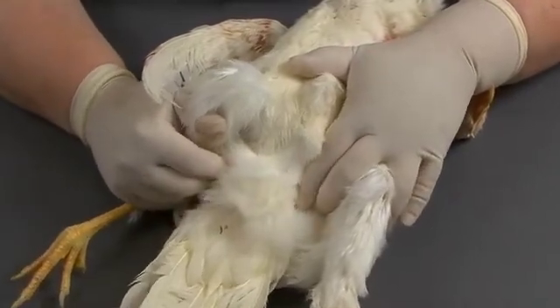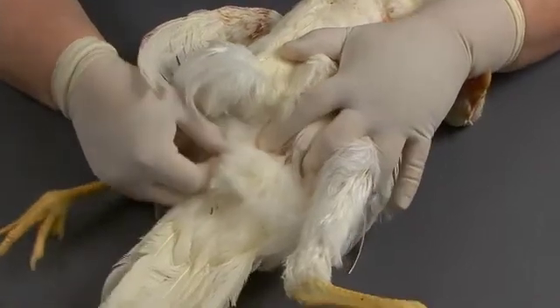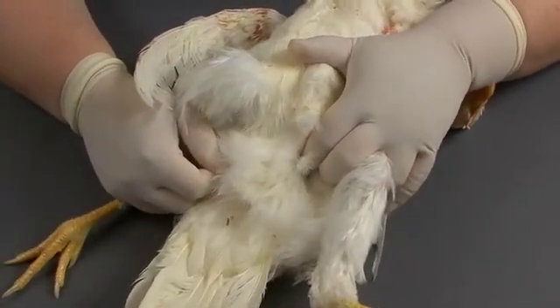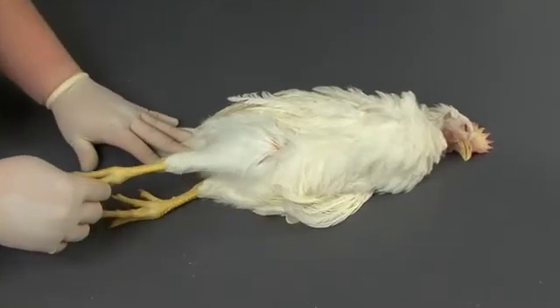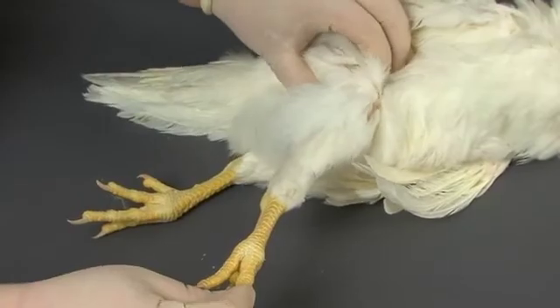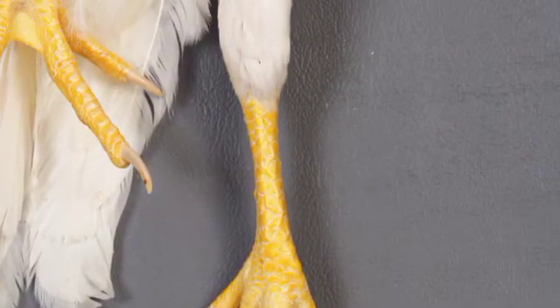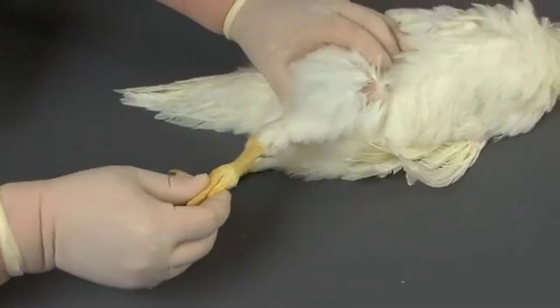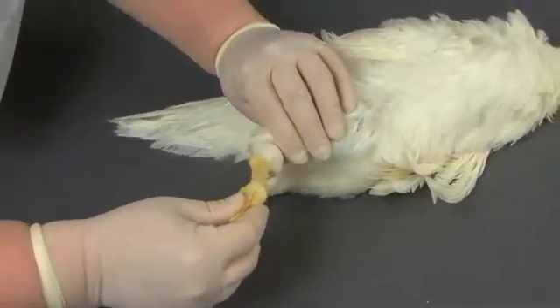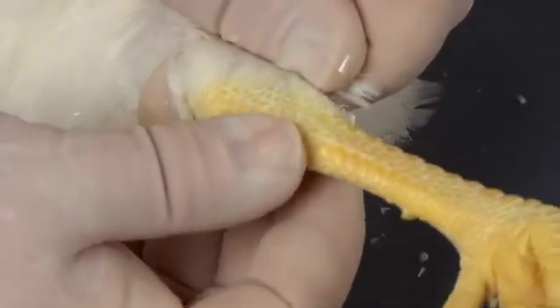Palpate the pelvic bones. In birds that are in lay, the pelvis should be flexible. Birds that have not been laying should have a stiff pelvis. Examine the legs. Palpate the bones along the legs for fractures and deviations. The leg bones should be straight and symmetrical. Flex and extend all the joints to assess range of motion, keeping in mind the effects of rigor mortis. Palpate the joints for swelling or effusion.